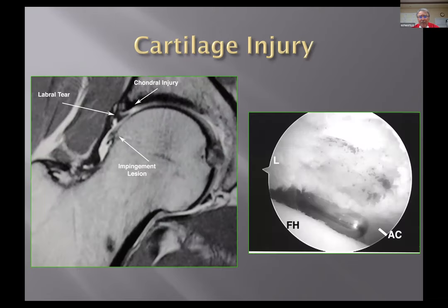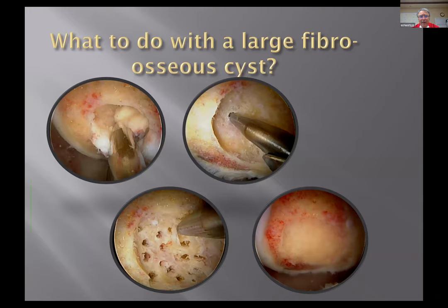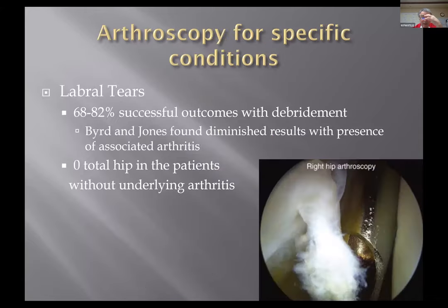Again, we're looking at the cartilage. We're looking at the labrum. We're looking at things that are causing impingement. Is there a lesion? And then all these things are what we see. Sometimes you'll see a cyst in the area of the acetabulum or in the head. You can microfracture these areas. Some people put a little bone graft in.